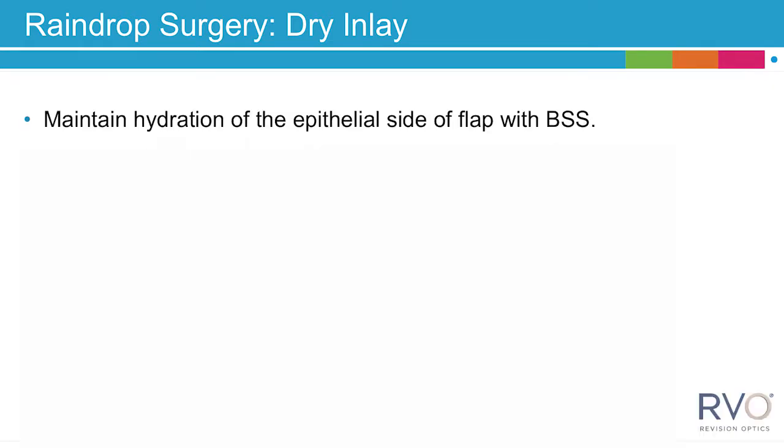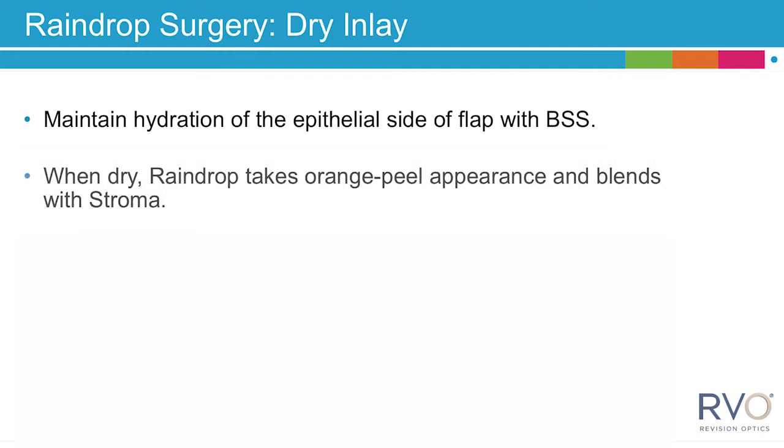While waiting for the inlay to dry, maintain the hydration of the epithelial side of the flap with BSS. When dry, the raindrop takes an orange peel appearance and blends with the stroma.